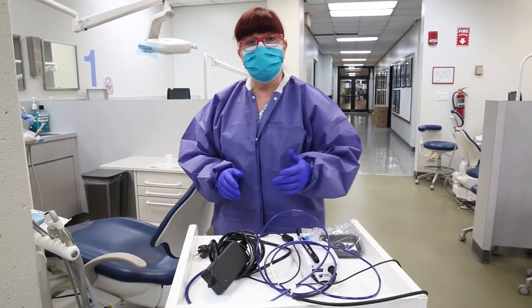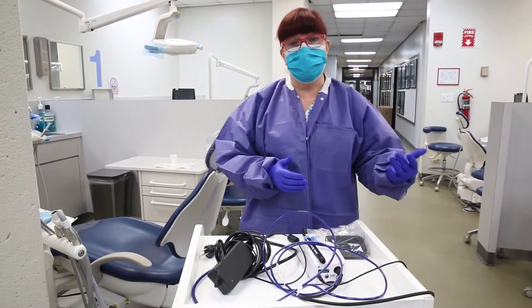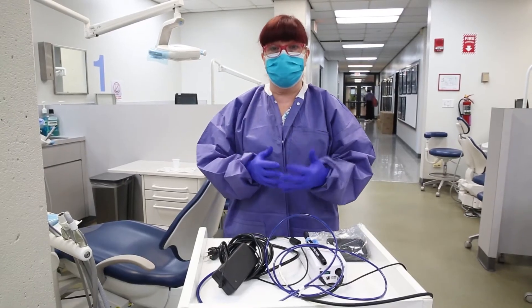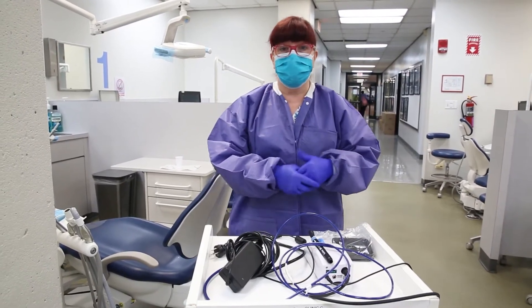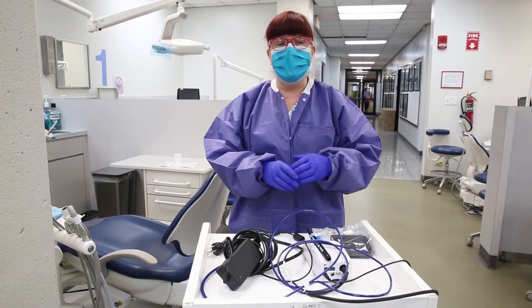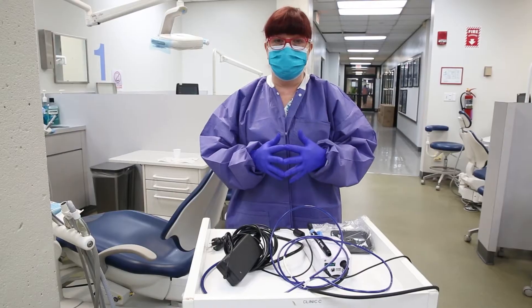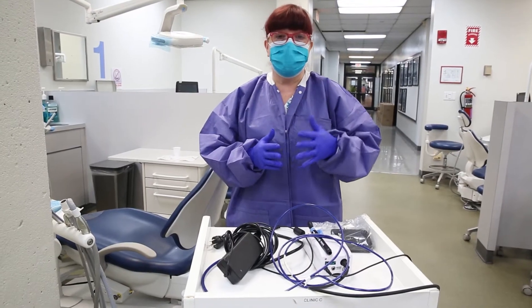If you are in clinics E, F, or G, the built-in ultrasonic in those units is a piezoelectric. The other ultrasonic video we have available is for how to use the ultrasonic scaler with the magnetostrictive inserts in clinics A, B, C, and D.